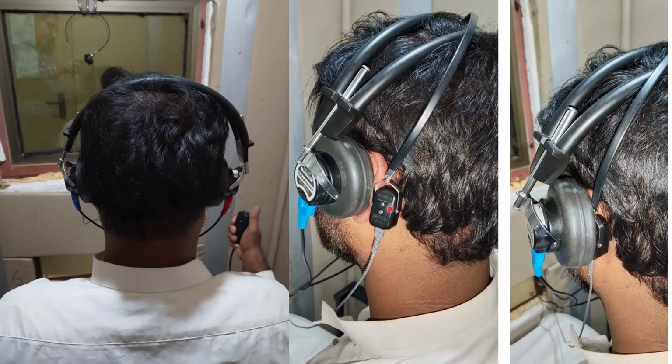Now in this picture, this bone vibrator is applied. Headphones are applied on both sides at one time, but the bone vibrator is applied only on one side. Once this ear is tested, the bone vibrator will be applied to the other ear, and then that ear will be tested.